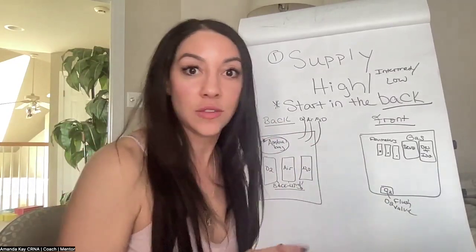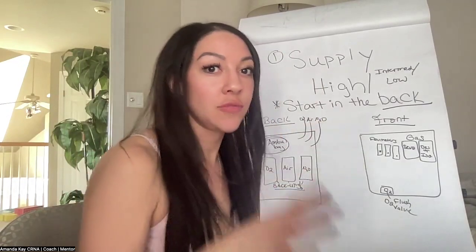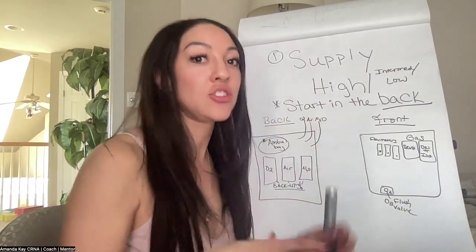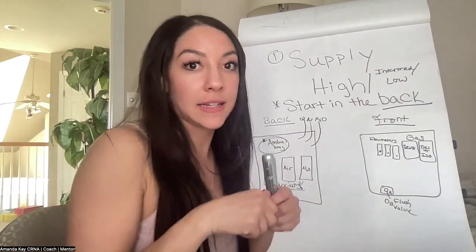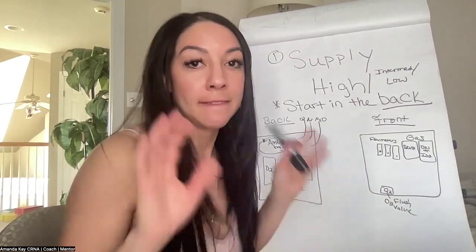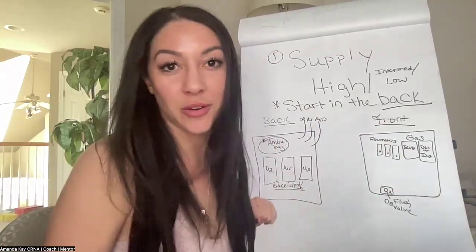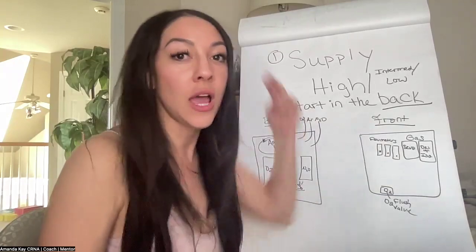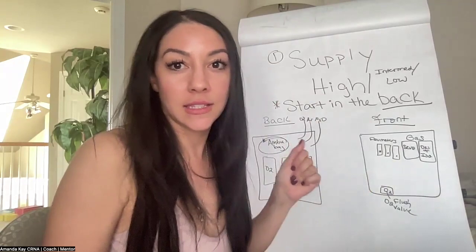Because I had a situation the other day where I had an issue with my machine, wasn't getting an oxygen flow, and I basically had to ambu the patient, grab a cylinder, just a cylinder off a stretcher, connect an ambu to that, and bag the patient. So always make sure, because if the machine is leaking it's not going to matter if those tanks are full, but you always want to make sure they're full. Always have a backup plan. If something happens in my machine, how else can I get oxygen in?